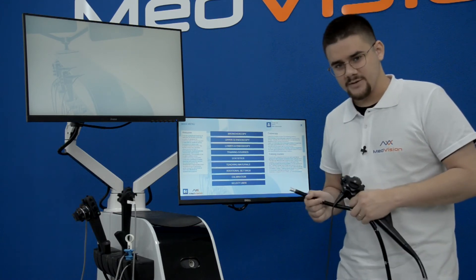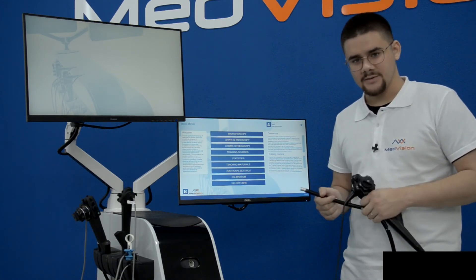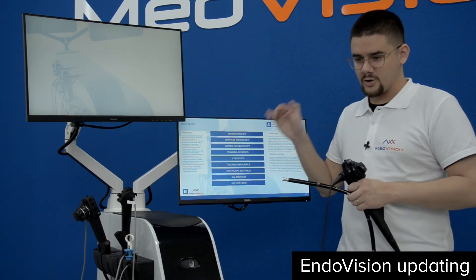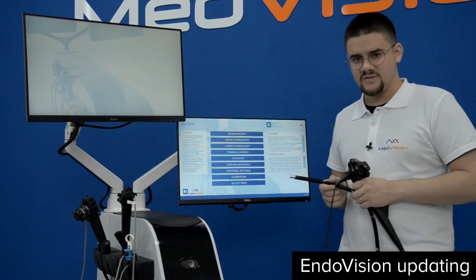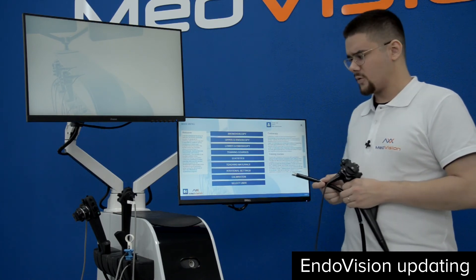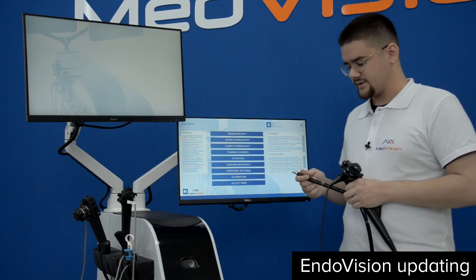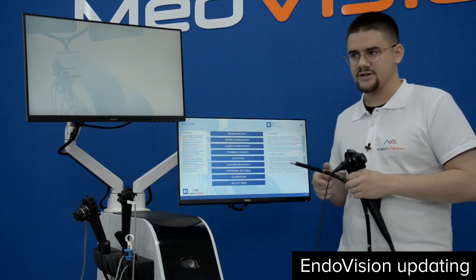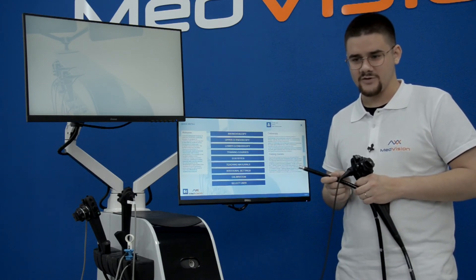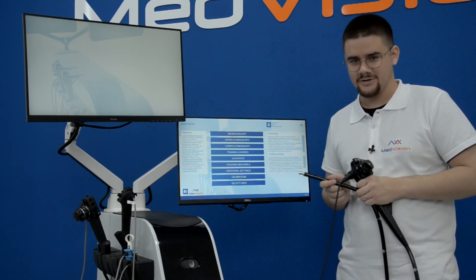In our training modules we also have different anatomies, and these can be updated online. To get an online update, go to Windows, enable TeamViewer, and either our software engineer will do a remote update, or in the future an auto-update feature will be implemented where you just connect to the internet and it updates automatically. Depending on when you watch this, it may already be in place.